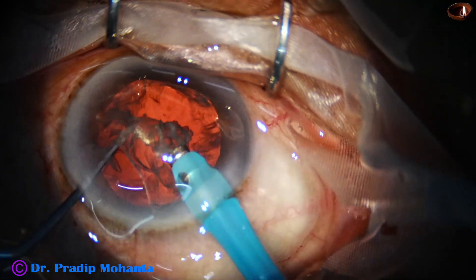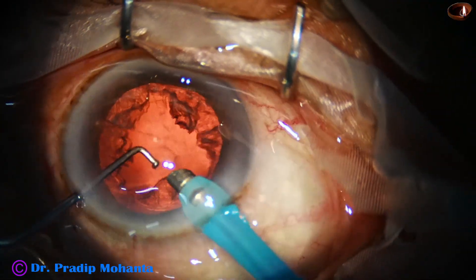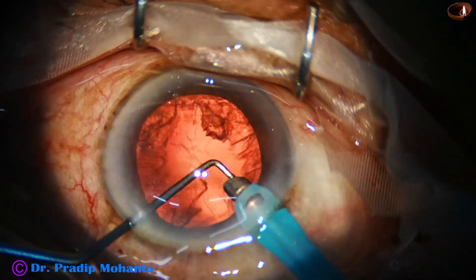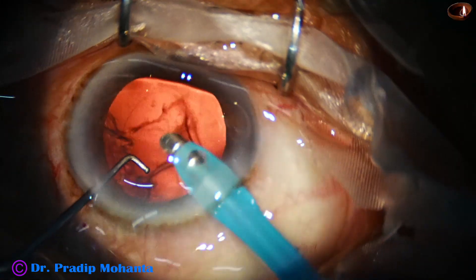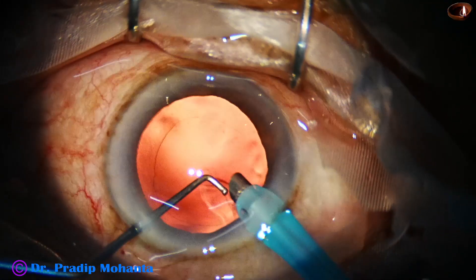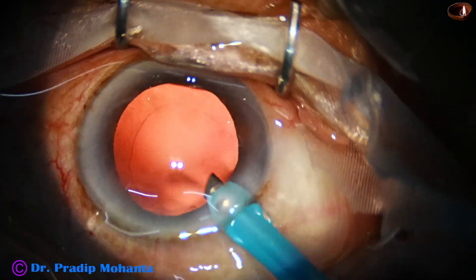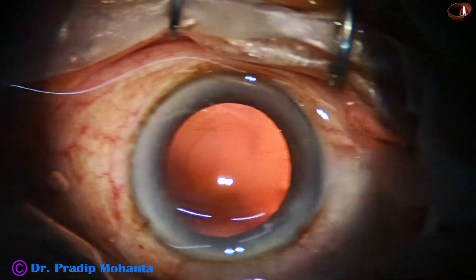Hard cataracts can also be divided. In some cases, with two or three attempts — come back and go again at a deeper plane — you can do the pre-chopping of a hard nucleus. But for hard nucleus, it is not necessary; you can do the submarine chop technique for hard cataracts.